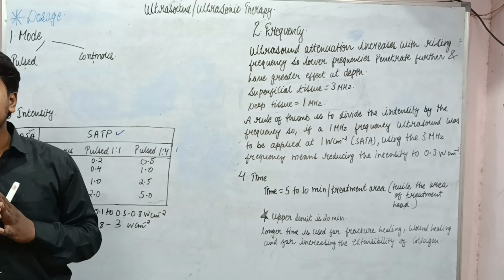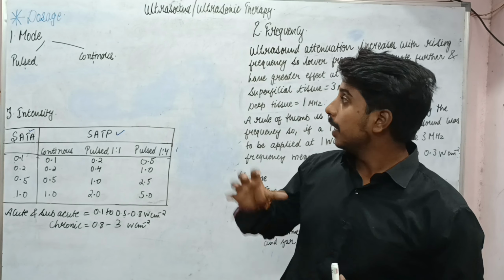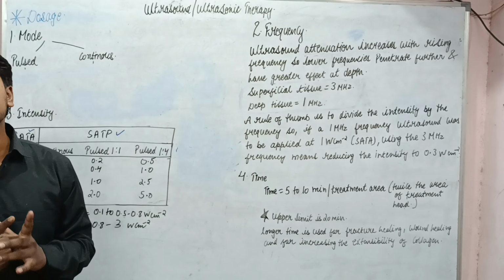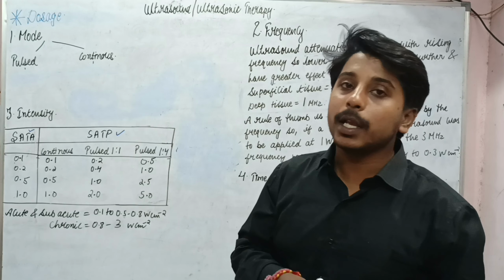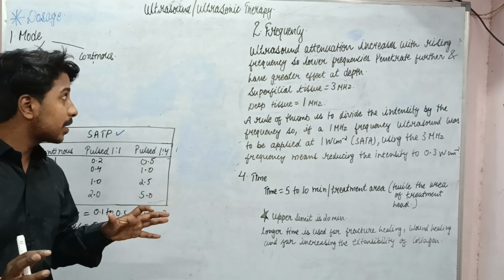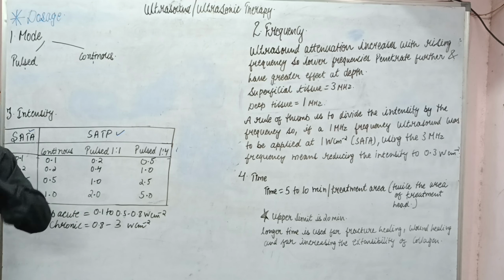We are back with our next and the last lecture on ultrasound therapy, and here we are going to study about the dosage of ultrasound, which is very important for good and fast therapeutic outcomes. My name is Vijay Kumar. So let's get started.